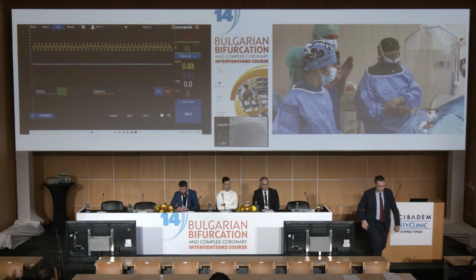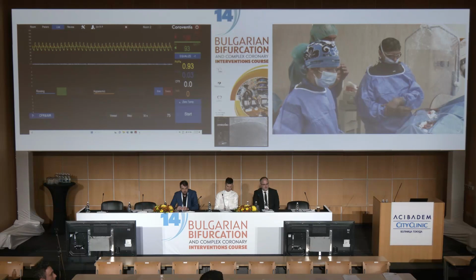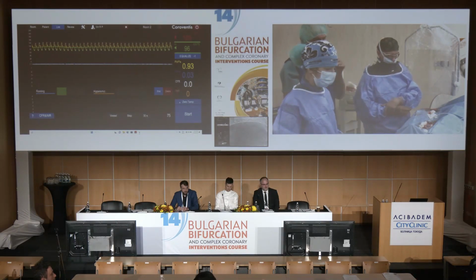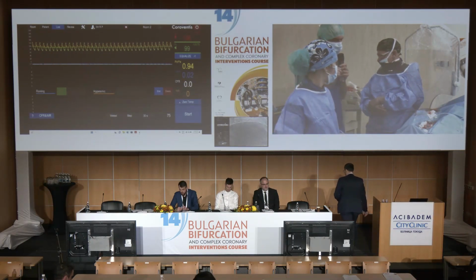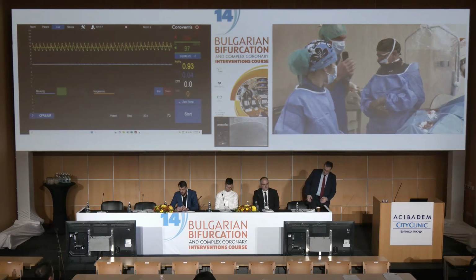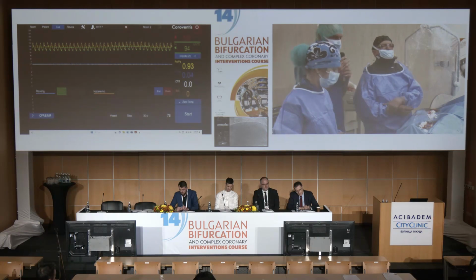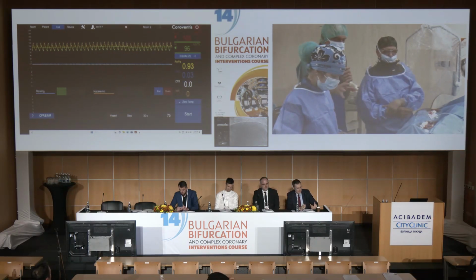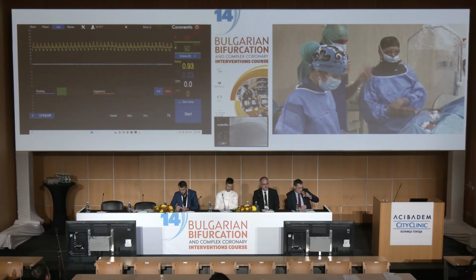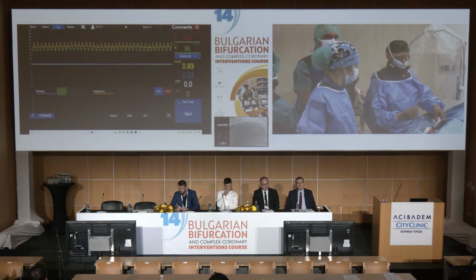So, bolus thermodilution, as the name tells us, is a recording of the temperature after injecting a brisk bolus of saline at room temperature, which means colder than the blood, in the guiding. And this is what we are going to demonstrate. We will do that 3 times at rest and then 3 times after hyperemia. I would like to suggest we start, because the patient is waiting on the table.